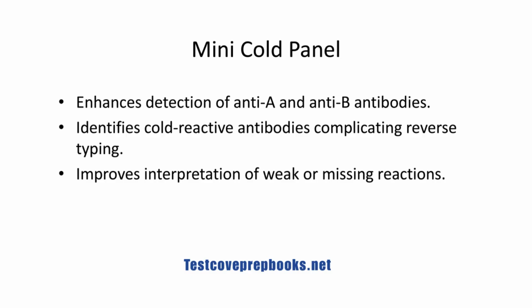First, it helps enhance the detection of anti-A and anti-B antibodies in a patient's serum when these antibodies are expected but not demonstrable at room temperature. By lowering the testing temperature, the reactivity of these antibodies can be improved, making them easier to identify. Second, it also aids in identifying cold reactive antibodies, those that respond to antigens at cooler temperatures.